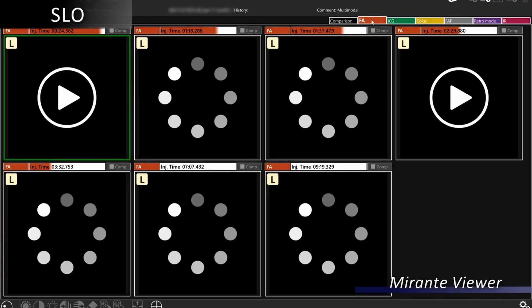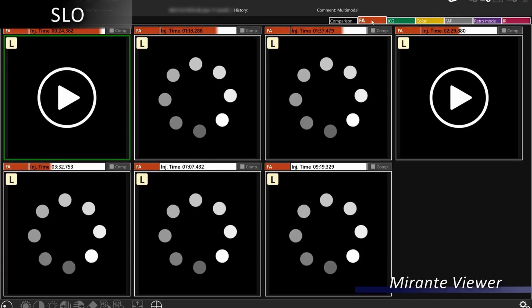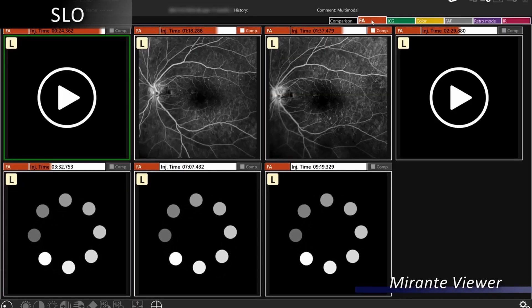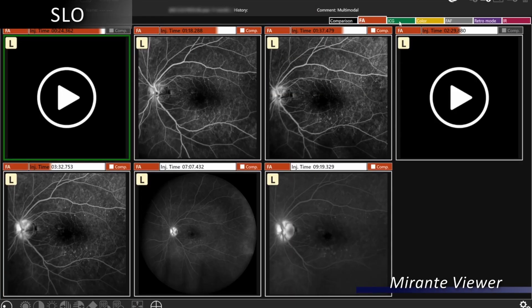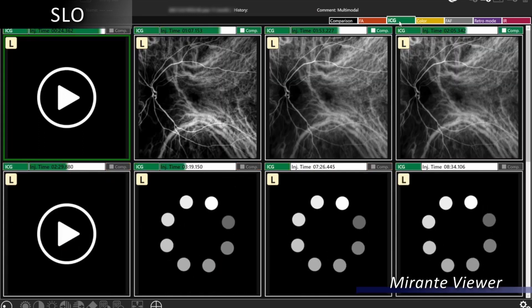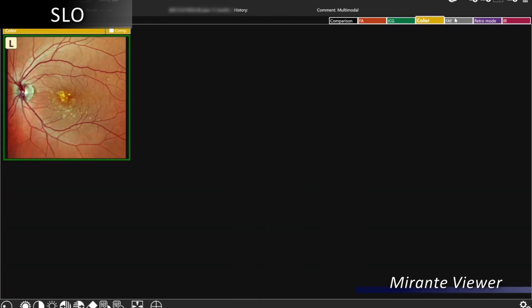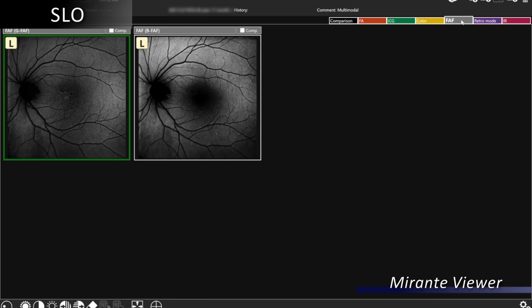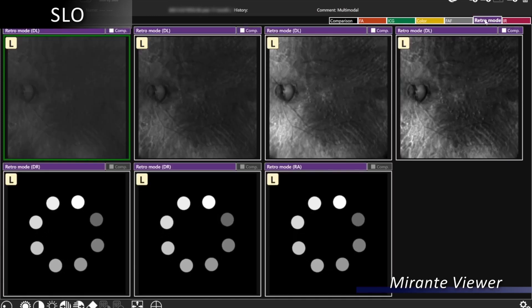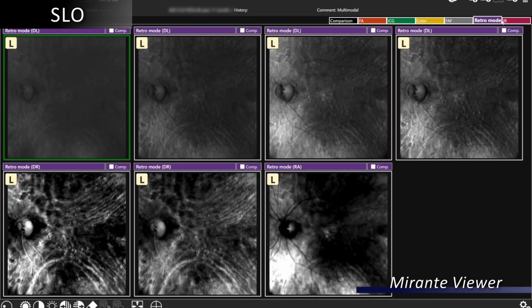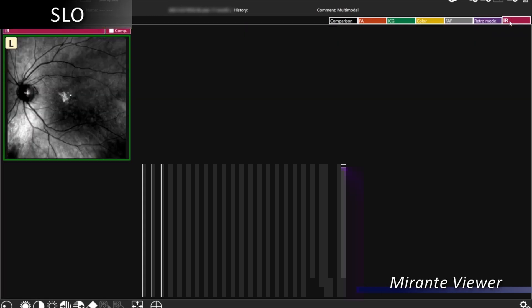By looking at the different modalities, we can image fluorescein angiography, ICG, color imaging, fundus autofluorescence blue and green, retro mode, and infrared.